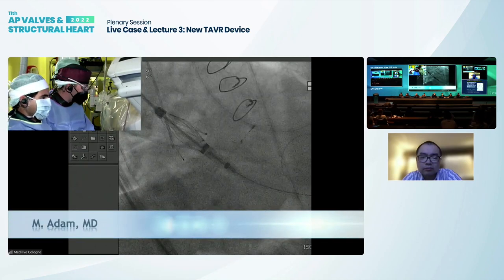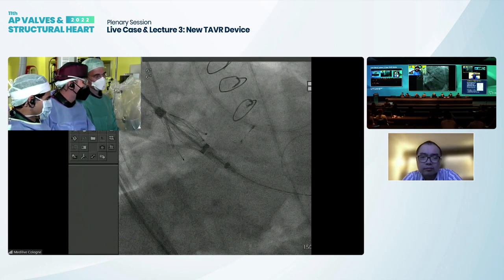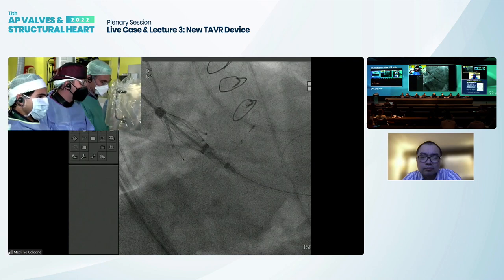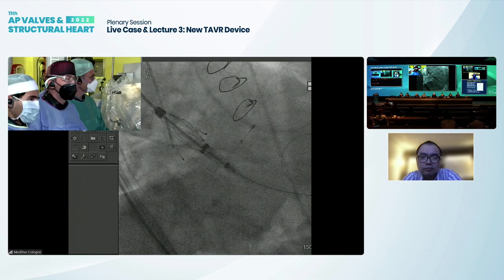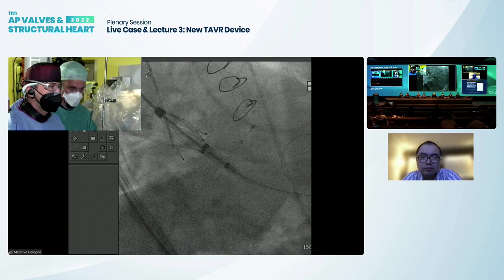Yeah, very nice. Okay, now to show you, we also have TOE in place, so that we can try to locate and visualize the locators by TOE also. So Dr. Körber, would you mind? Isabel, would you mind? Yeah, sure.